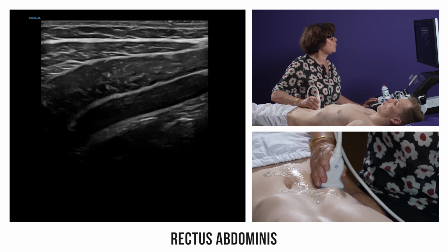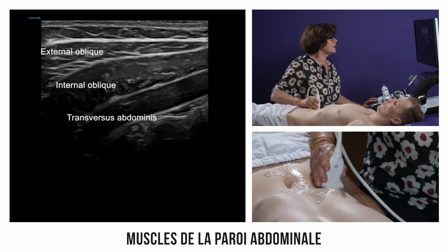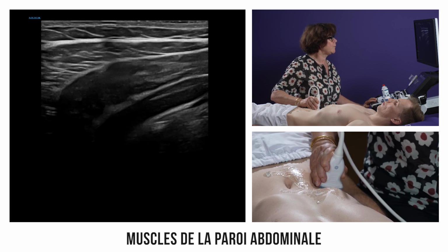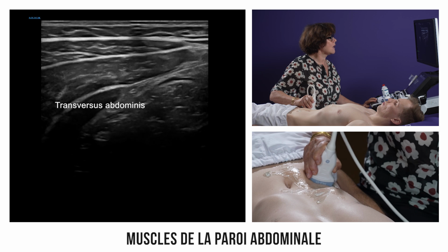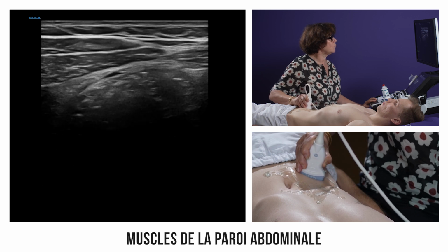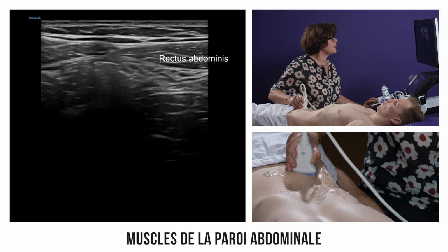Even further laterally, we can identify the three layered muscles from deep to superficial: the transversus abdominis, the internal oblique, and the external oblique. Slightly lower, we see the conjoint tendon, formed by the transversus and internal oblique, blending with the aponeurotic fibers of the rectus abdominis.